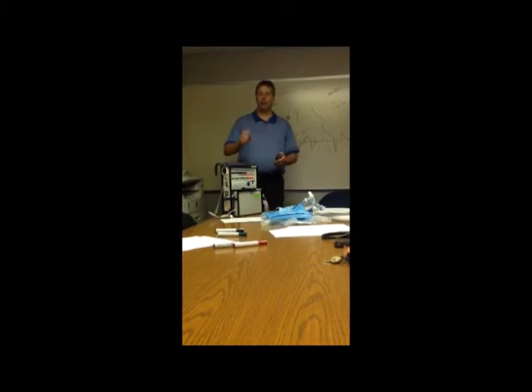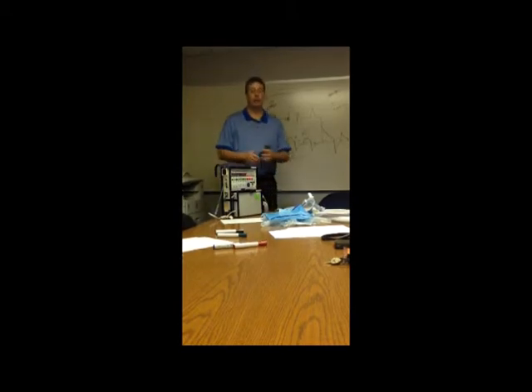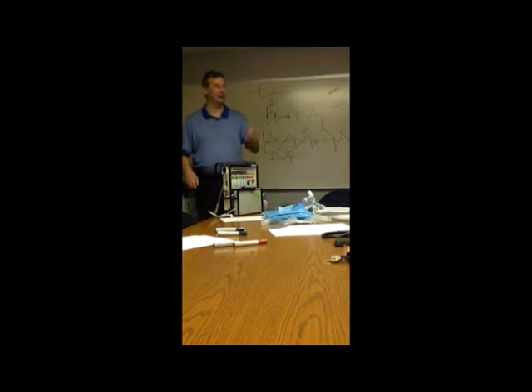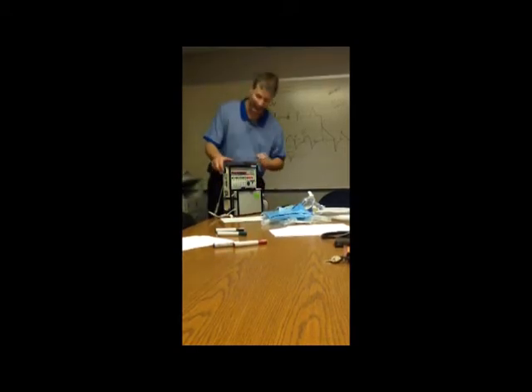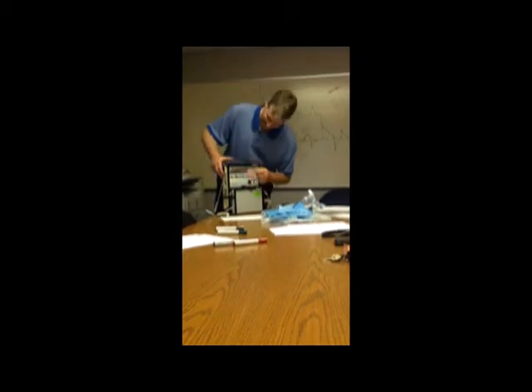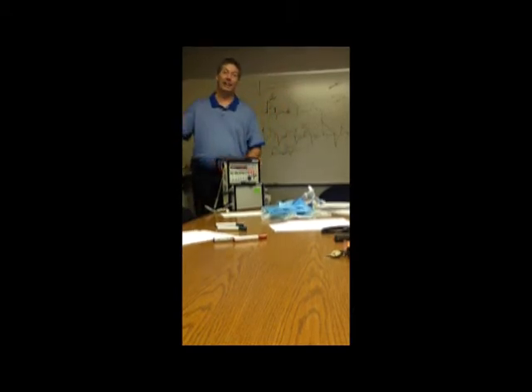This bar graph is the closest y'all have to waveforms. Waveforms are amazing for helping synchronize. I wish they had a bit just like this with a little waveform screen. It would be amazing for you guys. They got one that you add on to that now. So you think they're going to buy y'all that, right? No. You work at Novant, right? You're lucky they don't take this one out.